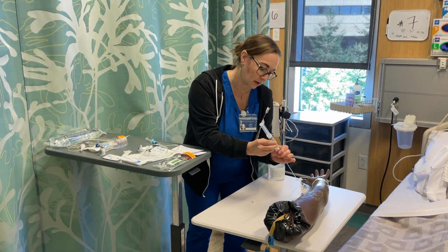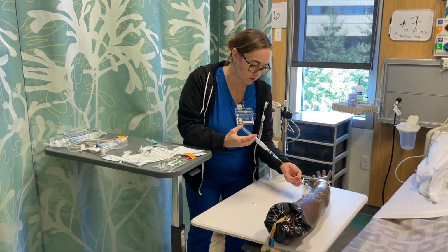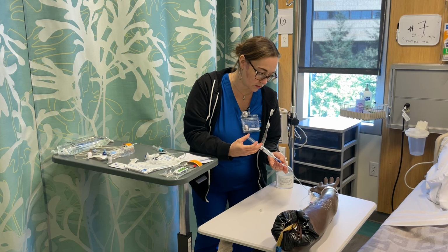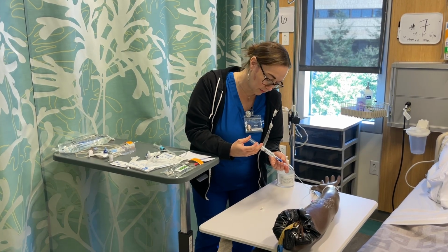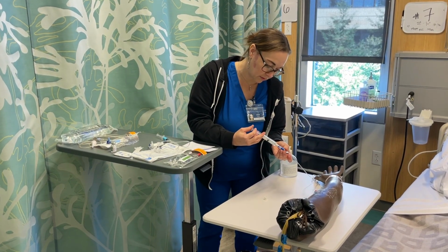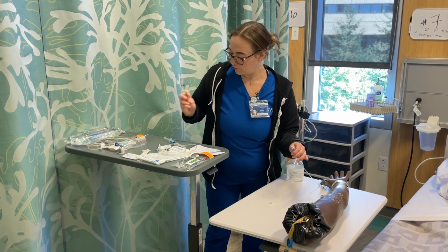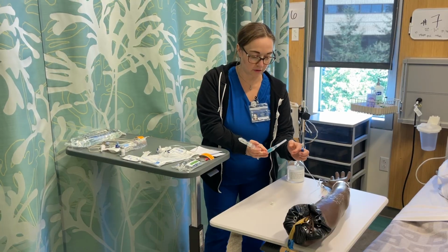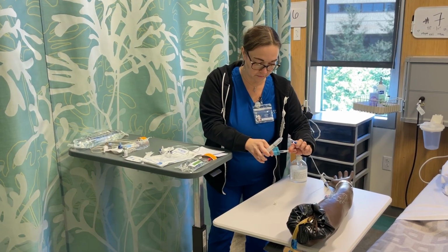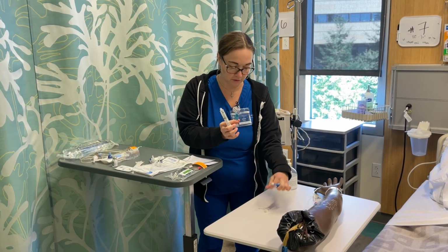This is going to go in at a milliliter a minute. And just kind of make sure that's, there we go. And kind of with the pulsing actions, not to irritate veins. So I would do this at a milliliter a minute. And I take that off. Now I'm going to administer the medication, and that was 4 milligrams. That was 2 milliliters. I throw that in the sharps.